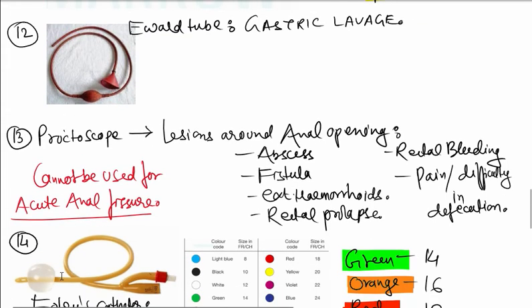Next one is the Ewald tube. This is used in gastric lavage.